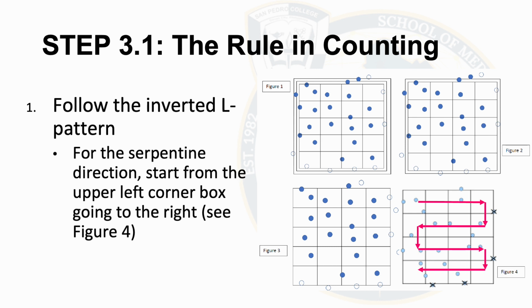Okay, now, again, this one is serpentine direction. We call it battlement technique. So, for the serpentine direction, start from the upper left corner box going to the right. So on and so forth.